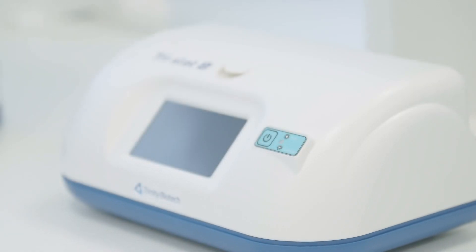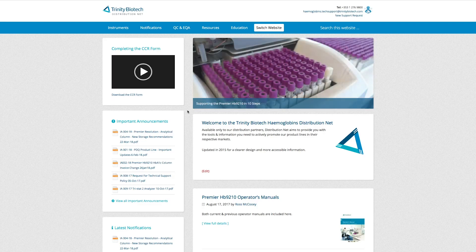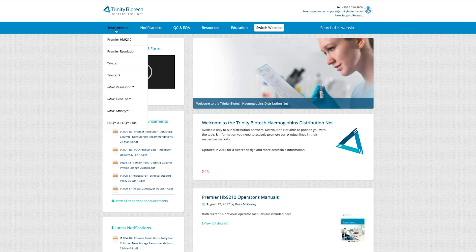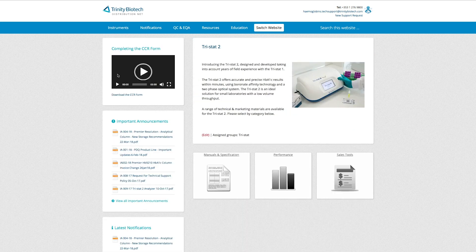This video will detail the Tristat 2 HbA1c patient sample test procedure. For more information, please refer to the operator's manual and quick reference guide, which are available on our distribution portal D-Net.